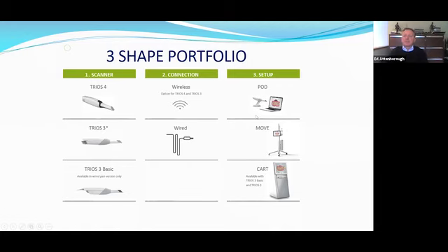Of course, if your practice is on different levels, and you're not going to equip every surgery with a scanner, and you're going to share it between surgeries, then obviously the practicalities of carrying it up and downstairs need to be borne in mind, and maybe that does make the laptop solution more attractive. These are all questions that need to be thought about when you're selecting the right technology.